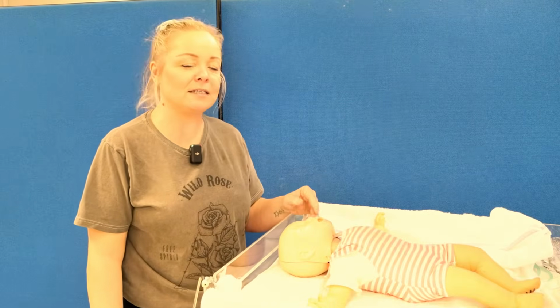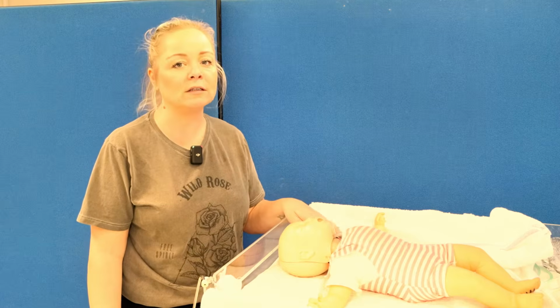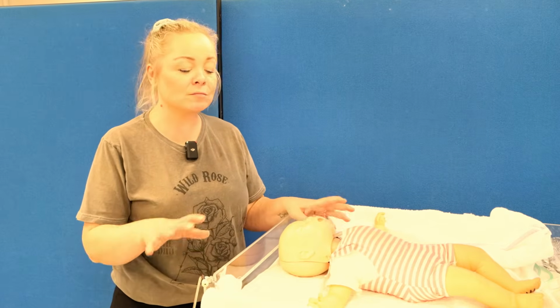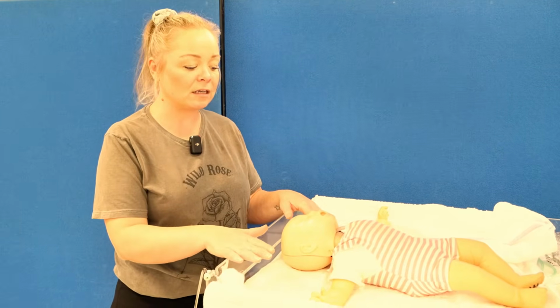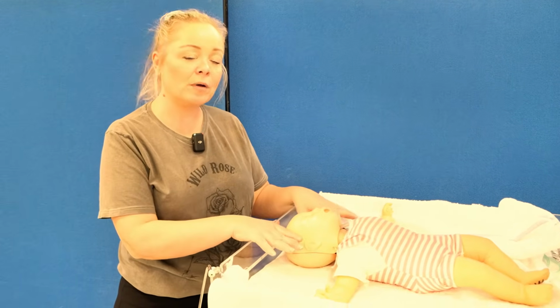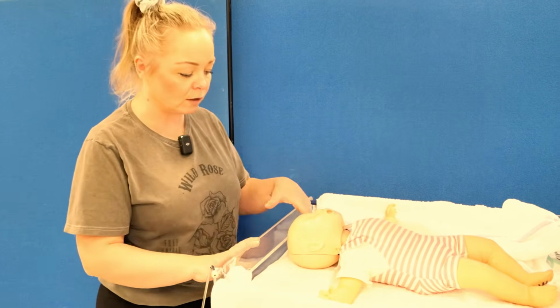So now we're going to break it down in stage 2 into more detail, and I'm going to explain why I've done what I've done and the rationale. There's also some differences for when another person arrives. We can use a 2-person technique with the bag valve mask and a 2-person technique with the chest compressions, which I will demonstrate in a short while.